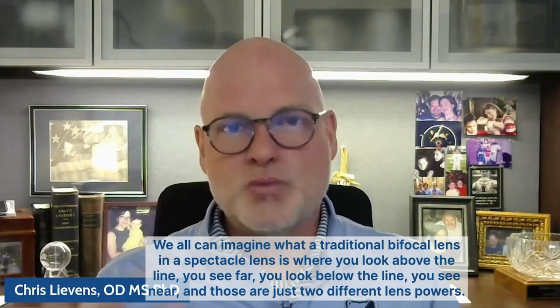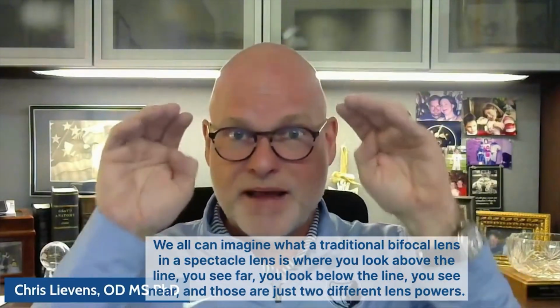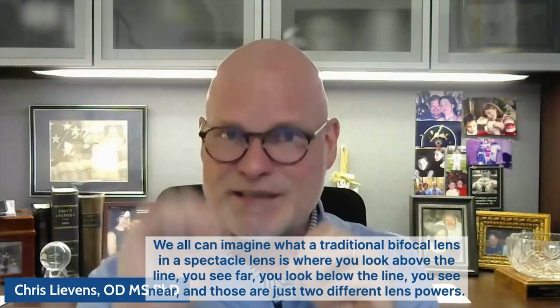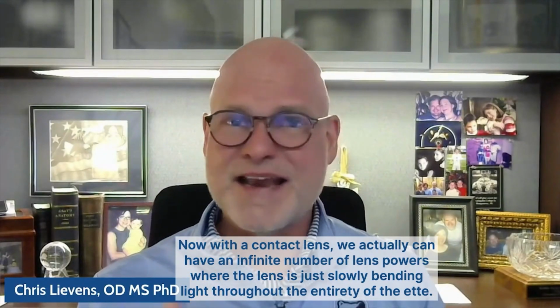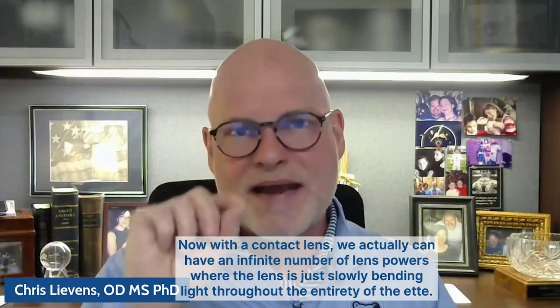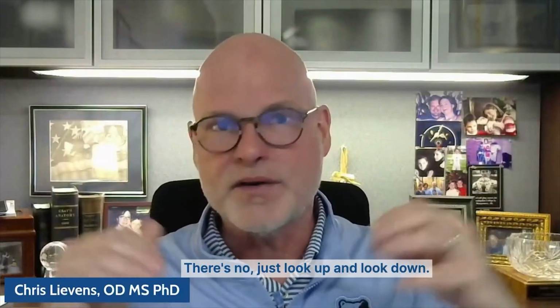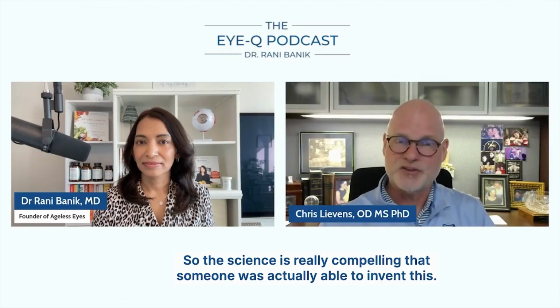We all can imagine what a traditional bifocal lens, a spectacle lens, is, where you look above the line, you see far, you look below the line, you see near, and those are just two different lens powers. Now, with a contact lens, we actually can have an infinite number of lens powers, where the lens is just slowly bending light throughout the entirety of the lens. There's no just look up and look down. It's just simultaneously, you can view all types of vision. So the science is really compelling that someone was actually able to invent this.